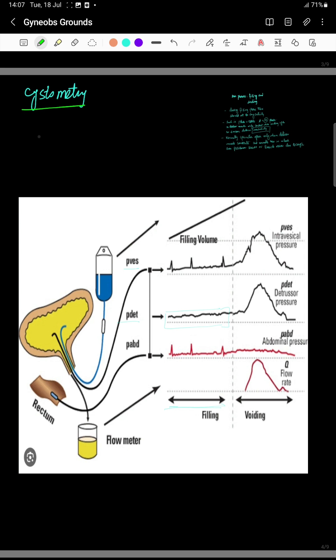Let's start. First of all, you have to recognize the two phases: the filling phase and the voiding phase. So first, identify what is the filling phase and what is the voiding phase on the graph. Here you see this is the filling phase — there is no activity of the abdomen, no activity of the detrusor muscle, and no vesical pressure. This is the voiding phase, where the detrusor muscles contract, the sphincter opens, and voiding begins.